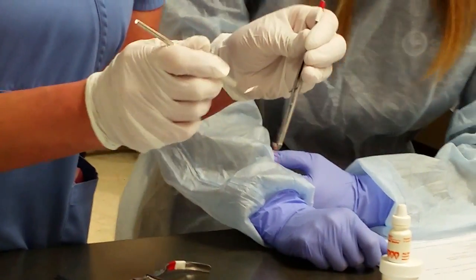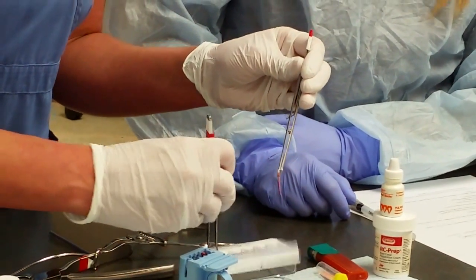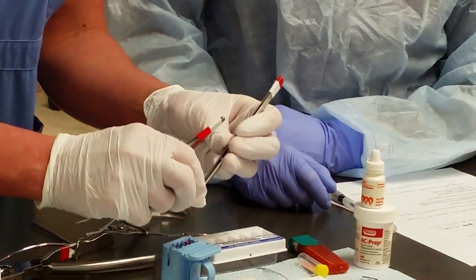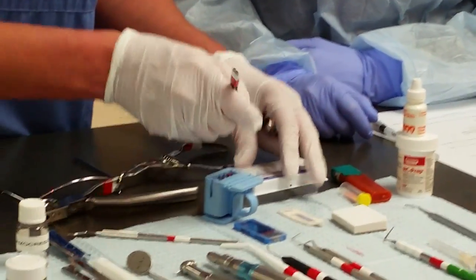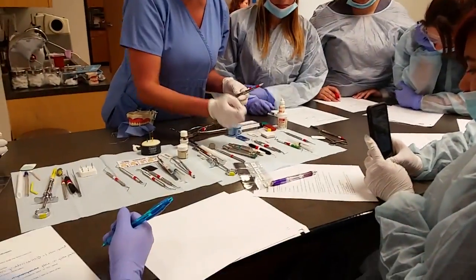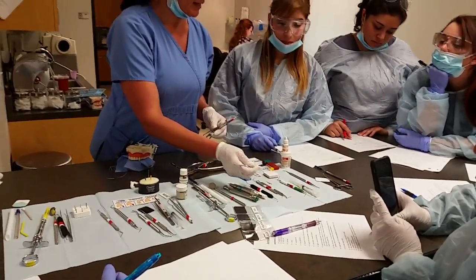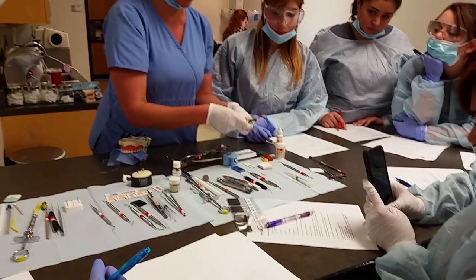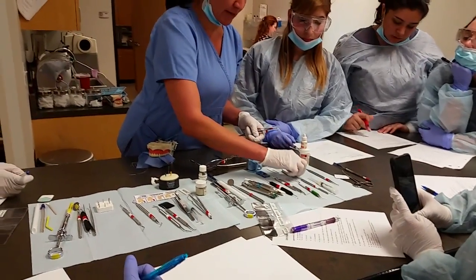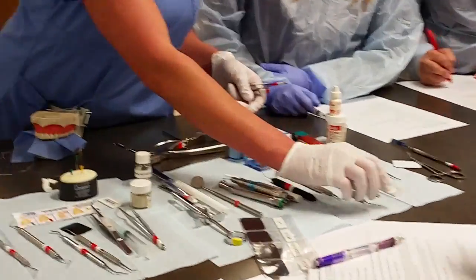We use the spreader to open the canal and spread it, making sure all the gutta percha is placed inside the tooth. You might place one large gutta percha first followed by smaller ones — they do come in different sizes, so you can place multiple gutta perchas in one canal. The spreader has a pointed tip; the plugger has a blunt tip. You use both the plugger and spreader to get the gutta percha deep into the canal.